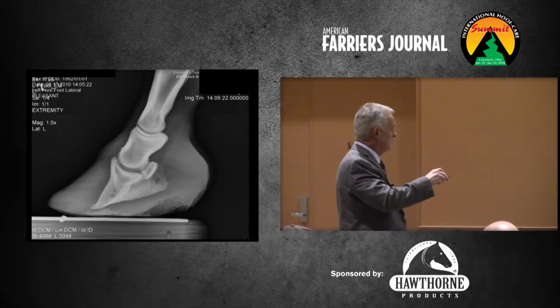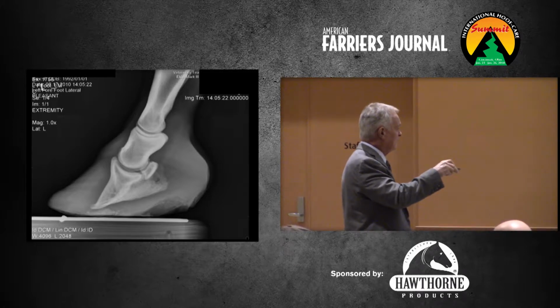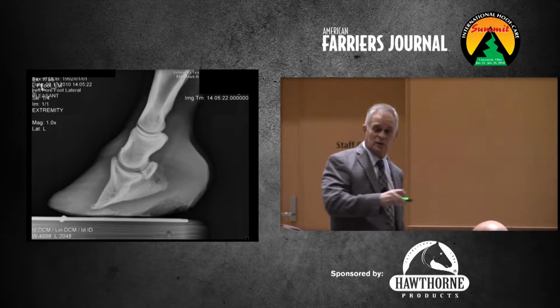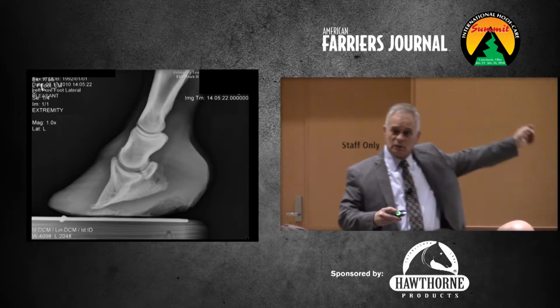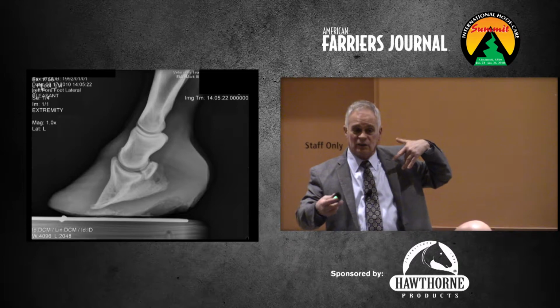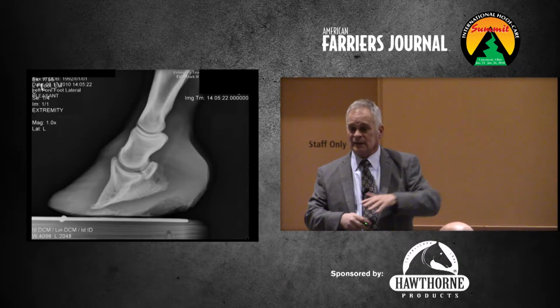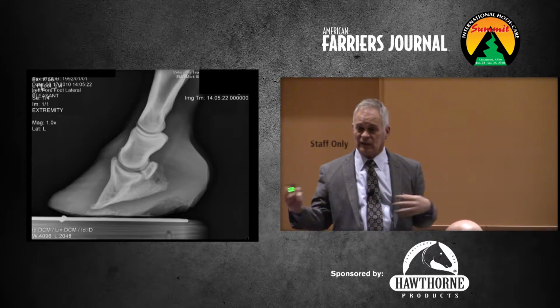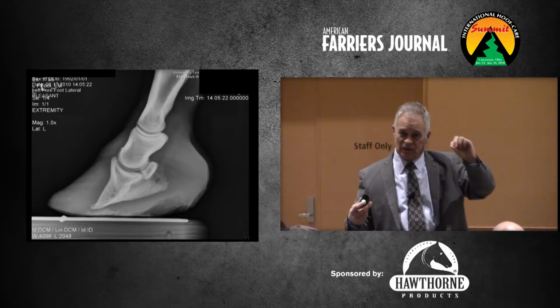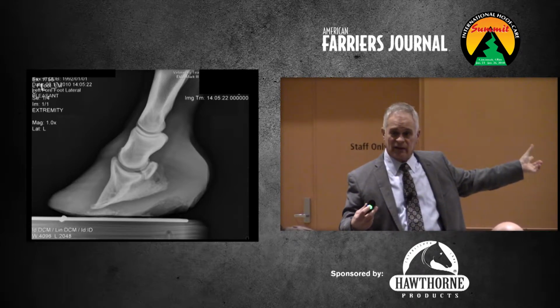So this one just happened from not taking enough heel and not taking enough off the front, but getting them short there. So she gets sore because she has no sole depth. That's what it is. But again, you could easily hurt a horse like this by taking a bunch of heel at one time, and they don't like it. But this one indicates it was from lack of depth. And that big lever probably doesn't make her happy either.